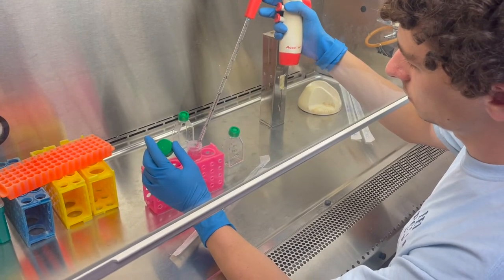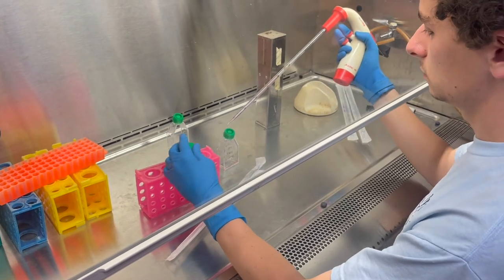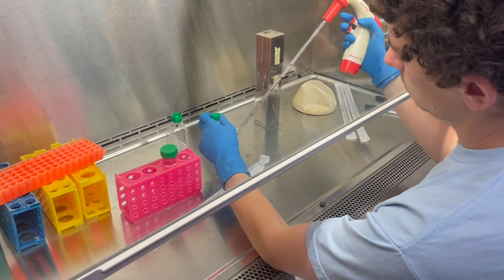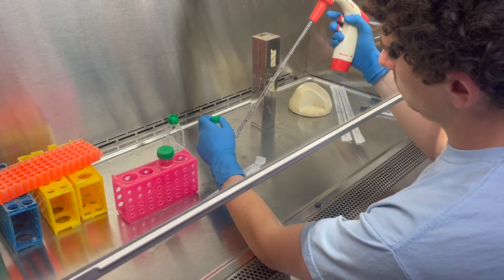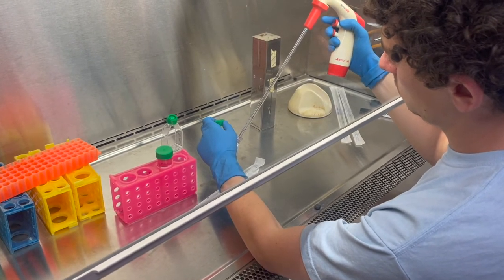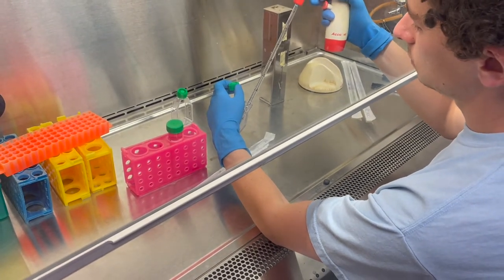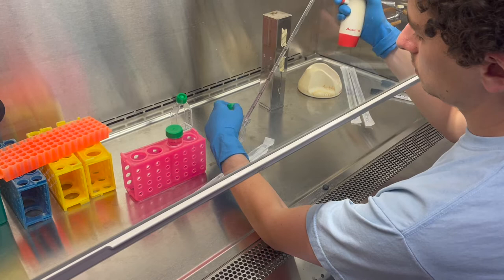Add media to the flask to re-suspend the cells using a plastic pipette. The total volume of trypsin plus media should equal 10 milliliters for a T75 flask or 5 milliliters for a T25 flask. Mix by pipetting up and down until all of the clumps of cells are gone.